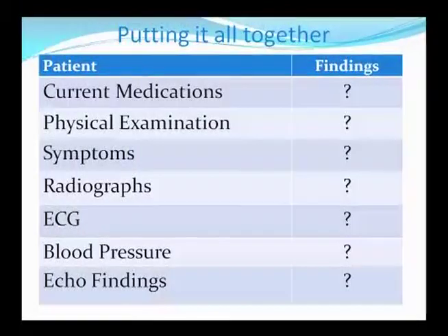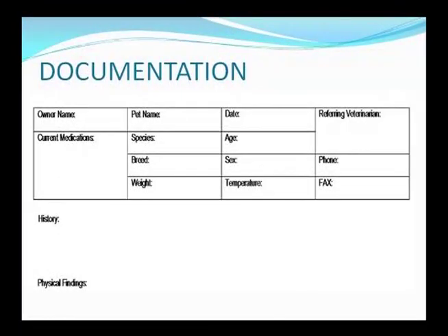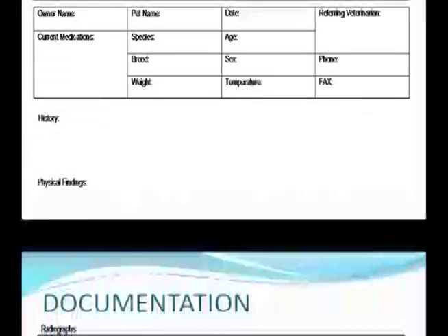Final diagnosis and treatment recommendations are not based on any one measurement, but should consider the patient's symptoms, blood results, radiographs, ECG results, blood pressure, and ultrasound results. All ultrasound measurements should be considered as guidelines to help evaluate cardiac function and not as absolutes.